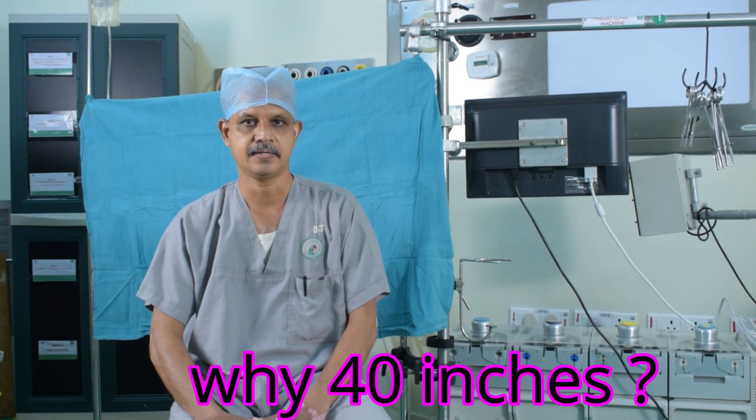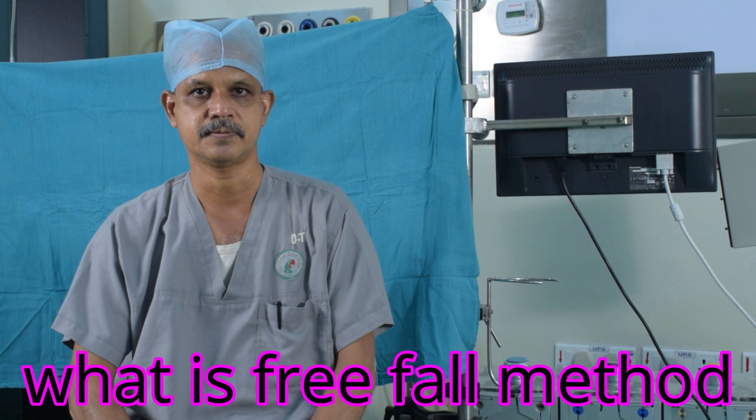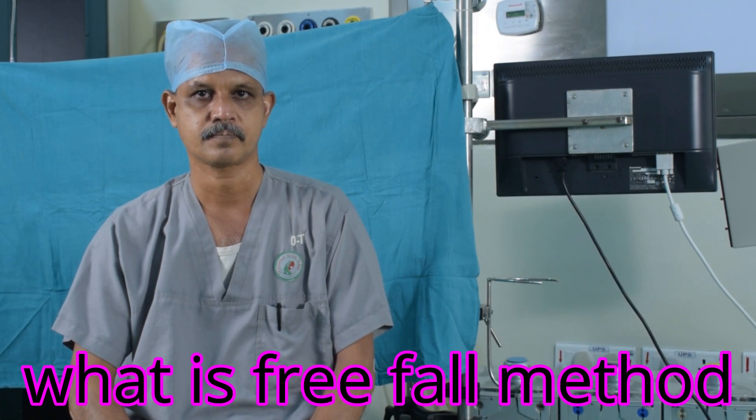In this method, the fluid column is raised from the pump head to about 40 inches and the pump is stopped. Why 40 inches? The 40 inches is usually the level of the height of the patient lying down from the pump head. The hydrostatic pressure between that level and the circuit should be in equilibrium. This will facilitate that as you move the rollers, the corresponding amount of fluid will be propelled into the patient's body.